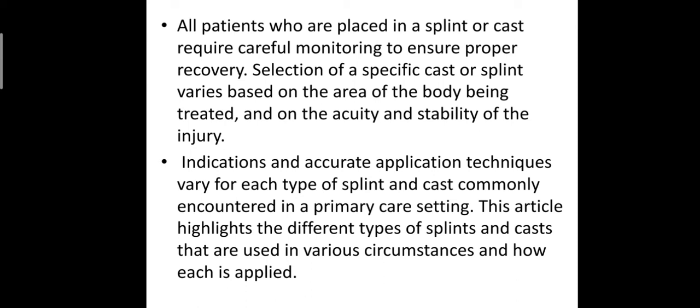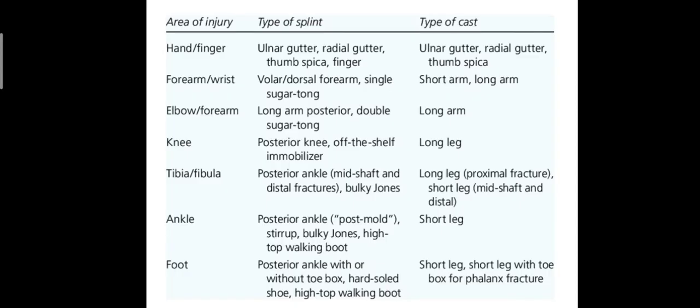This article highlights the different types of splints and casts that are used in various circumstances and how they are applied.